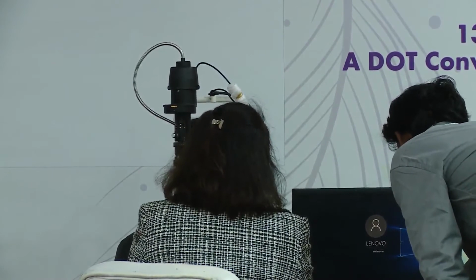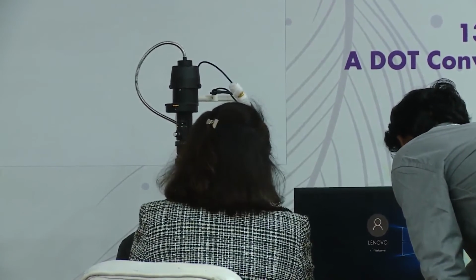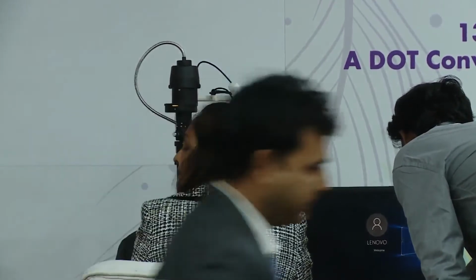One thing about insertion for those that fit scleral lenses: it's very easy to get bubbles when you insert it. The way you avoid that is you fill the lens with non-preserved saline, you put a drop of fluorescein in it, you have the patient stand and lean over, and then you insert it. I always ask the patient to get involved. I have the patient hold their bottom lid down, and I only need to hold the top lid up, so you only have to manage one.